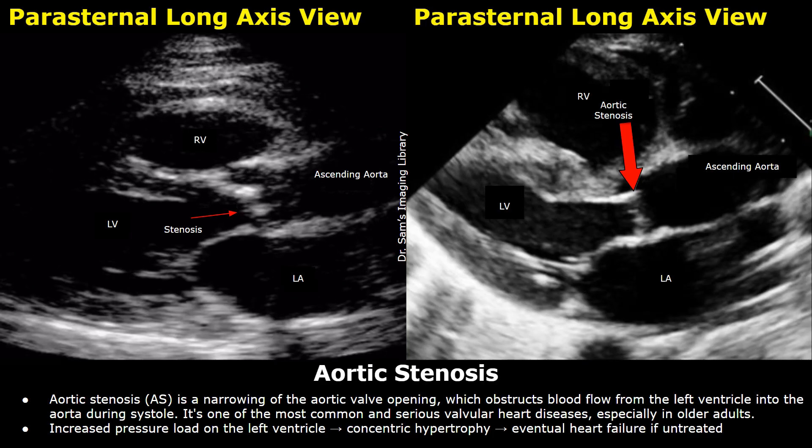Hello everyone, this is Dr. Sam and today you will learn about aortic valve stenosis on echocardiography. Aortic stenosis is a narrowing of the aortic valve opening which obstructs blood flow from the left ventricle into the aorta during systole.